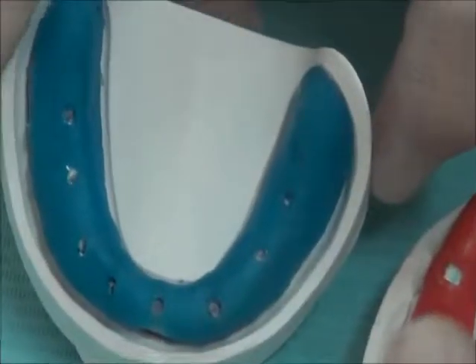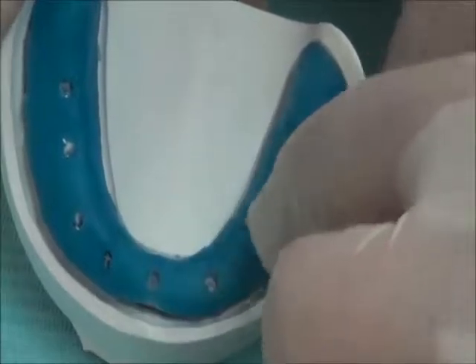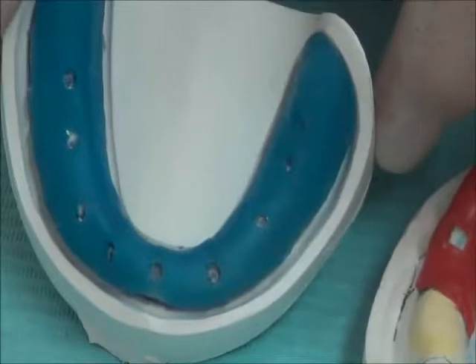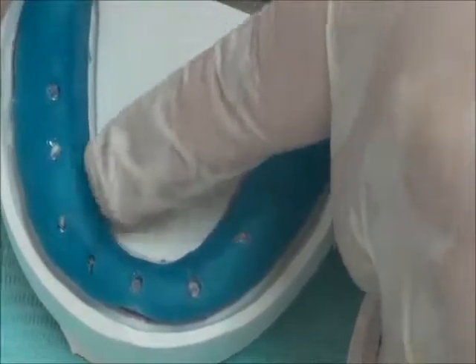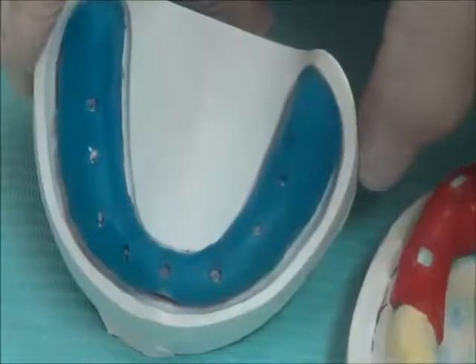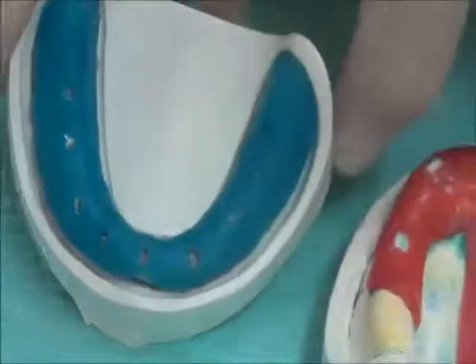Once under impression, the impression material can escape from these holes and the pressure beneath will be reduced. While on the slope area where no holes are present, the impression material is compressed between the tray and the tissue, and we will have a tissue compressive status. So tissue static here, tissue compressive here.